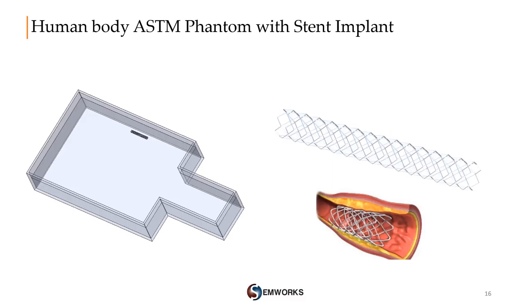Now, for the next step, we will try another frequently used passive implant, which is the cardiovascular stent. It is placed in the central side part and placed 2 cm from the phantom wall. This location provides a highly uniform tangential electric field over a length of approximately 15 cm.